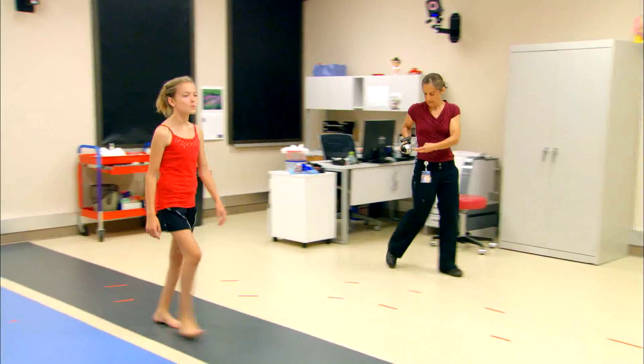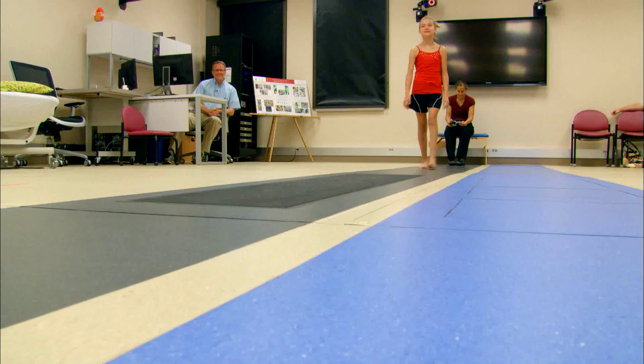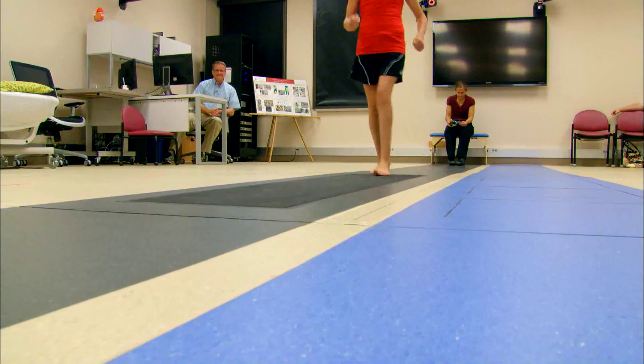We came to the motion analysis lab to have Jessica do some walking exercises to see what muscle groups really needed to be worked on for her to be able to walk correctly. My cerebral palsy leg, my left leg, that's what they were trying to look at — to see how they could help me and what they could do, and help me with the surgery and help me with a better future.